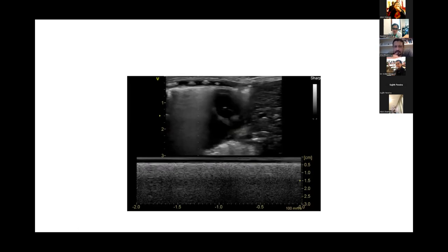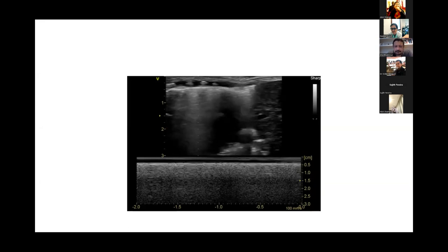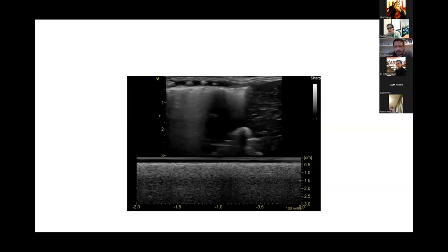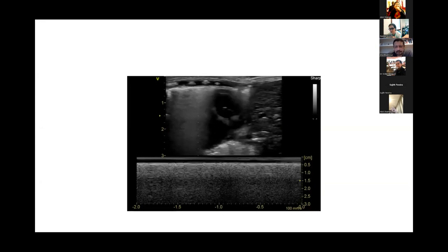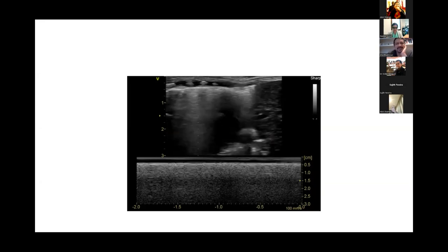There is absolutely no sign of no lung sliding or no movement. Of course, it looks a bit different because I think you have the lung pulse with it, so the pulse and the sliding are kind of mixed up. It's right beside the heart. If you do not have any movement of any kind, lung pulse or lung sliding, then in the time where you don't have these movements, you would see the same thing, the parallel lines, all the way down. Okay, I see. Yes, got that. Thank you.